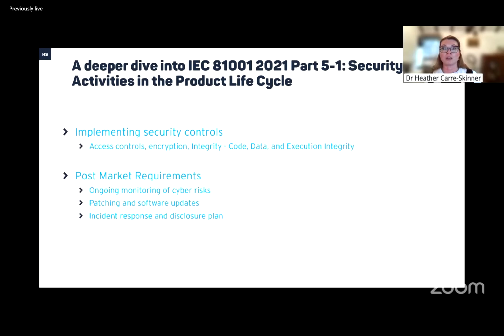Encryption, what level of encryption is used? Is data protected in transit, at rest, and also integrity of the code. So we're looking at coding techniques, the way data is managed, and the way that the code is executed as well. And also, probably most importantly, is post-market requirements.